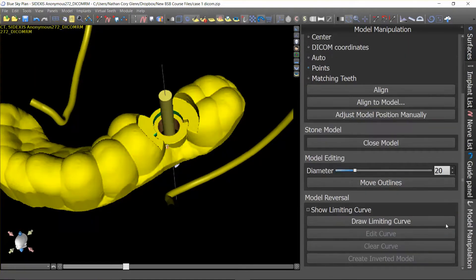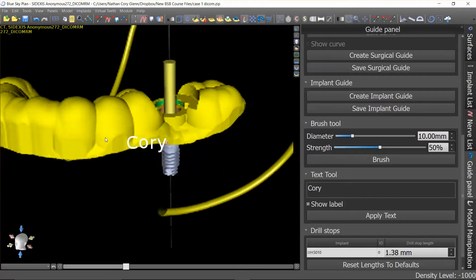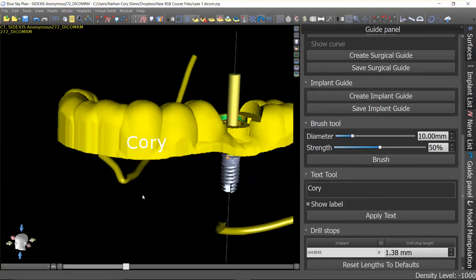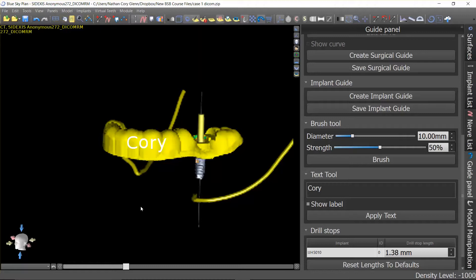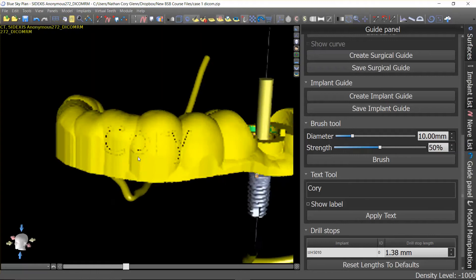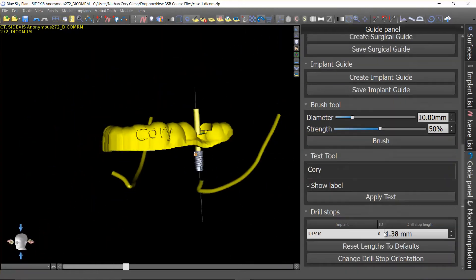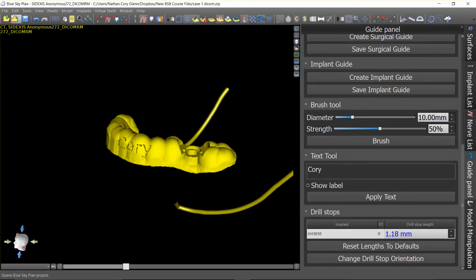One other thing you might want to consider is embossing text onto the guide. In the guide panel, toward the bottom there is a text tool — you could put the patient's name in there. Position the model behind the text and however it appears when you push apply text, it's going to emboss it into that position. If you have a lot of cases and multiple guides in cold sterilization, this is a nice way to keep track of what's what. You can also put implant sizes and other useful information.